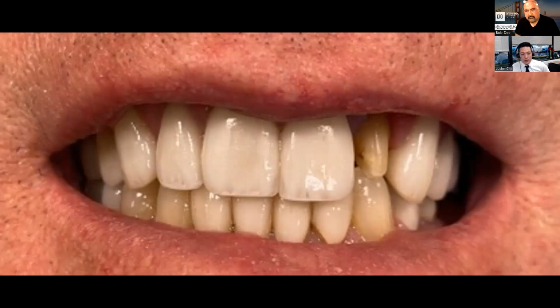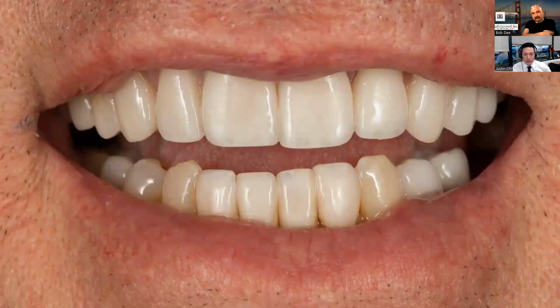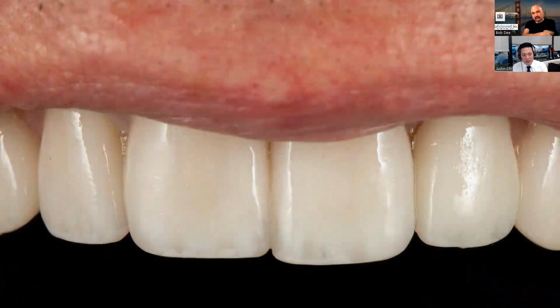Just an example of utilizing this material. This patient, apologize for the blurriness of the picture, sent this photo to us. This case was done by a dentist in Chicago, near you, Bob. The number 10 popped off, and he's now living in California. The dentist reached out to us, and he came to us for a solution. He had Emax veneers on his anteriors, upper and lower, and for that number 10 we just did an obsidian and did some surface characterization. Here's a closer look at it. Looking at it after the fact, there are some contouring changes that I would make, but overall, the patient was extremely thrilled.